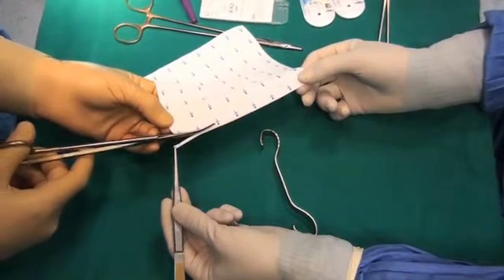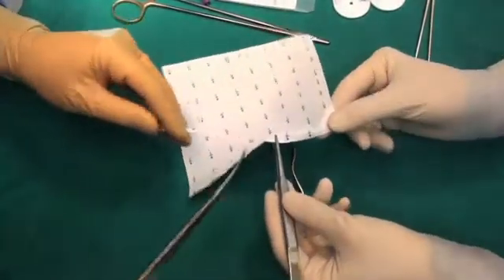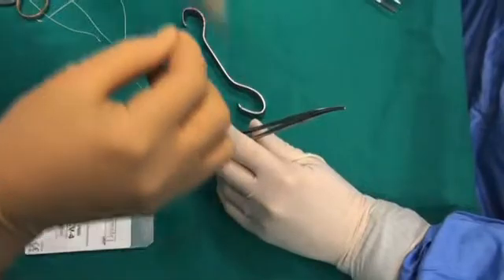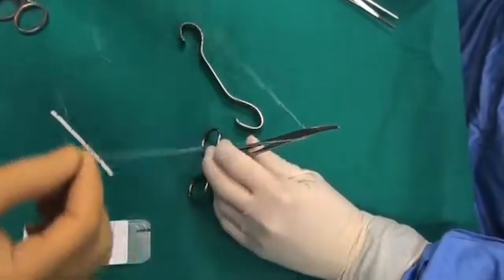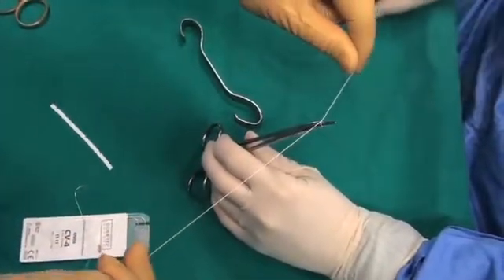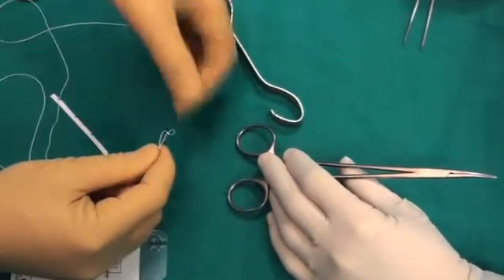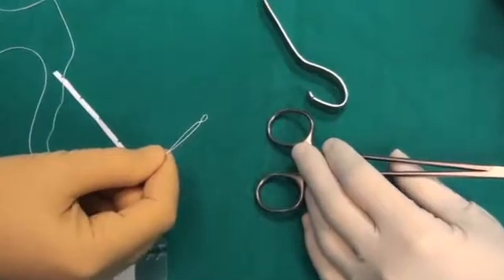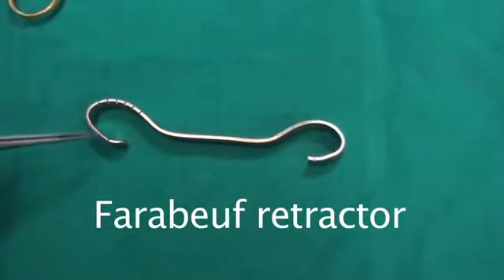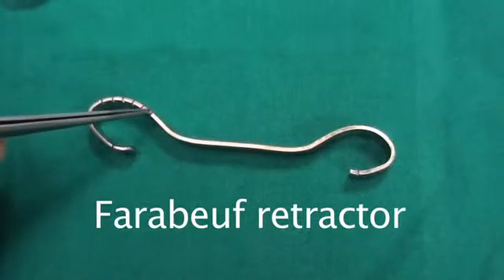First, an 8cm long strip of dacron is prepared, along with two stitches of 4-0 Gore-Tex. We make two little loops this way. This is a Faraboeuf retractor, custom made, modified so that the distance between the bottom and the upper incision in the edge of the instrument is the same as the echocardiographic measurement.